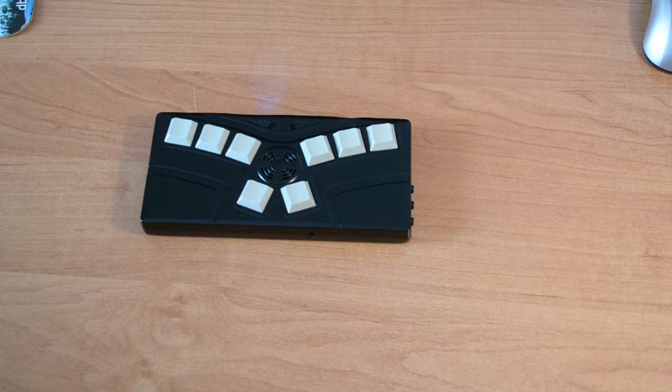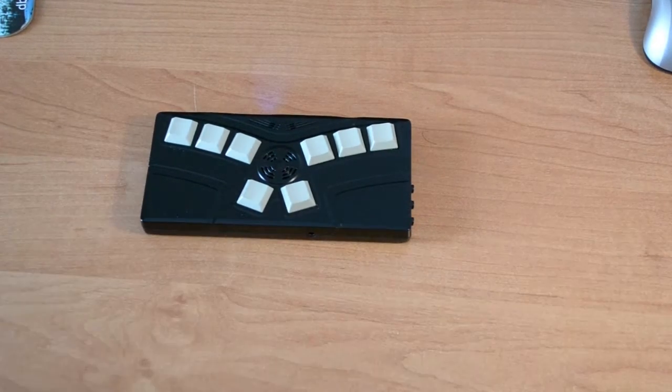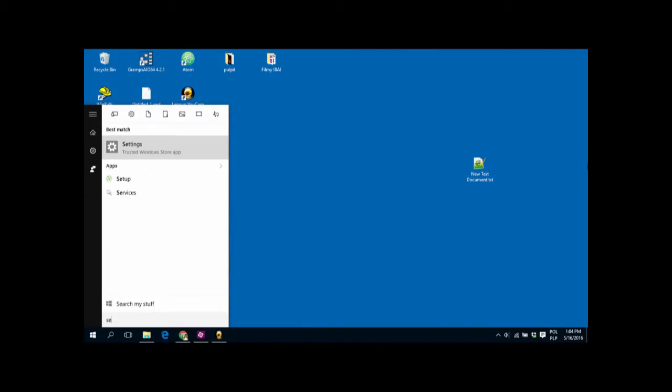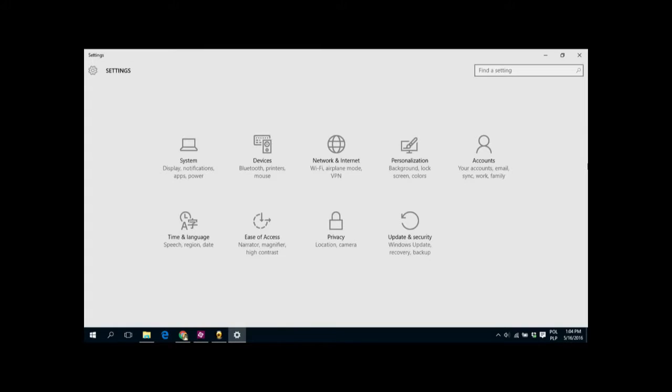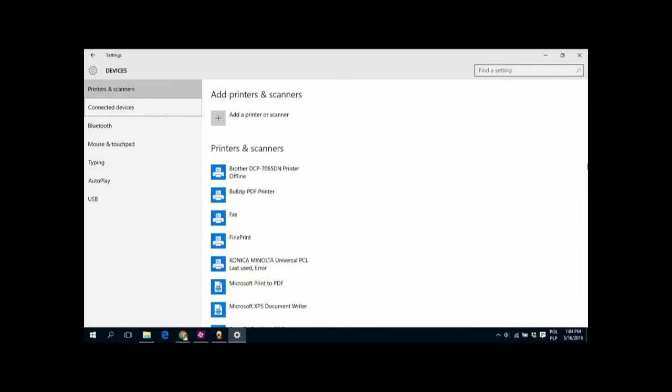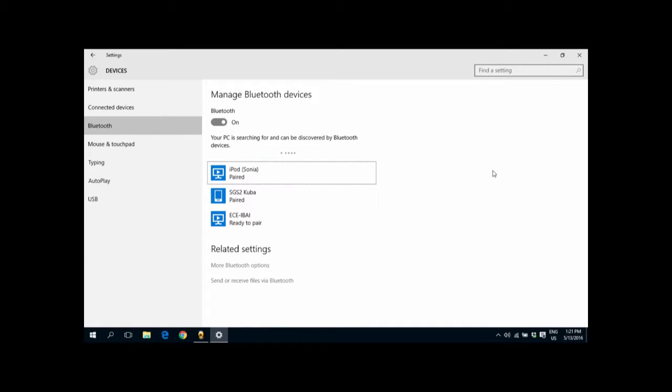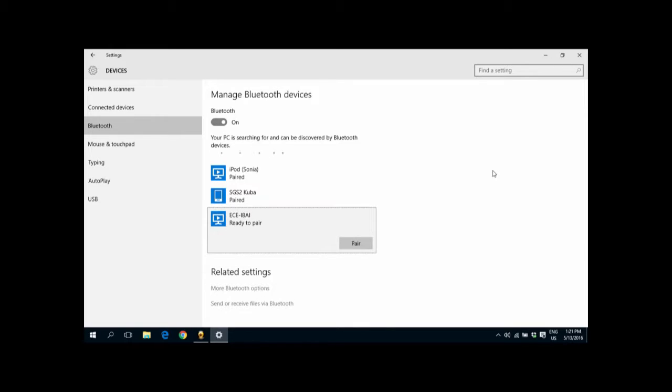So we have to take the device which we want to connect to the IBAI and start the connection of the device. I will show you how this works on the computer. So let's go to the computer screen now. I will open the main menu and try to find Bluetooth settings to be able to switch the Bluetooth on the computer. Okay, the Bluetooth on my computer was off, so I will switch it on.